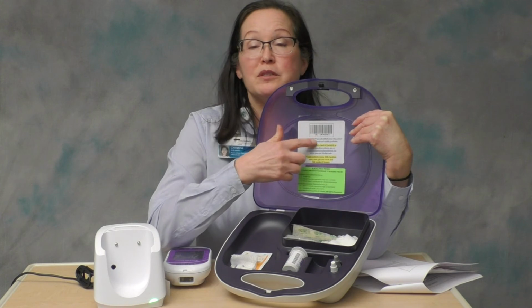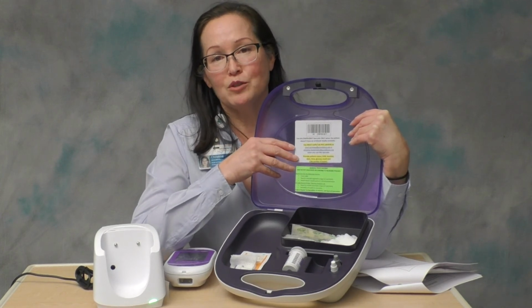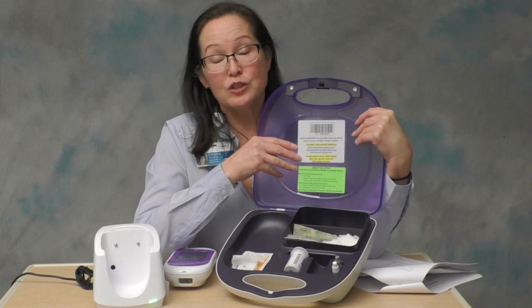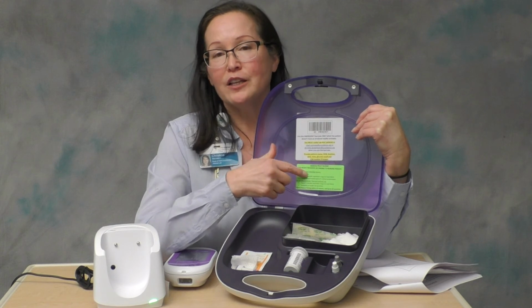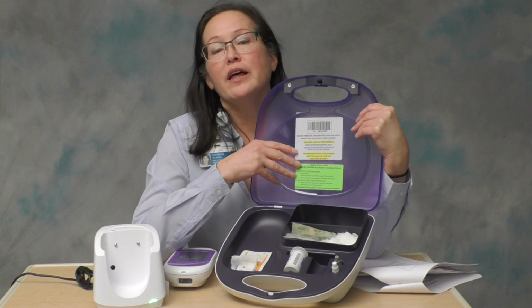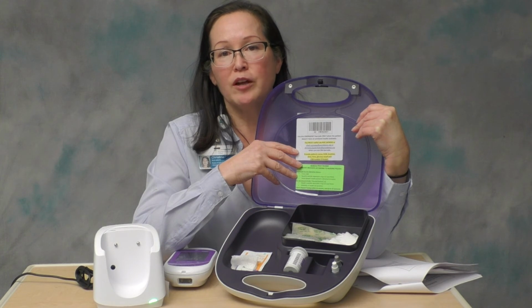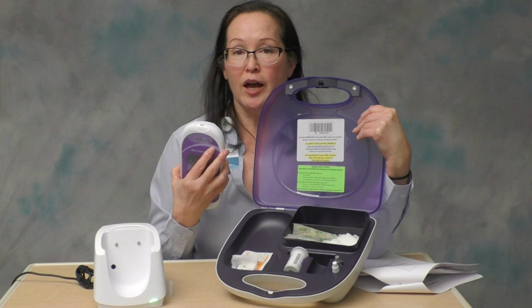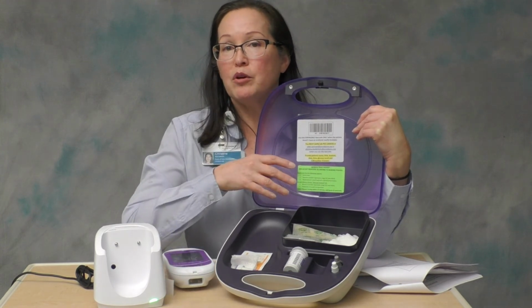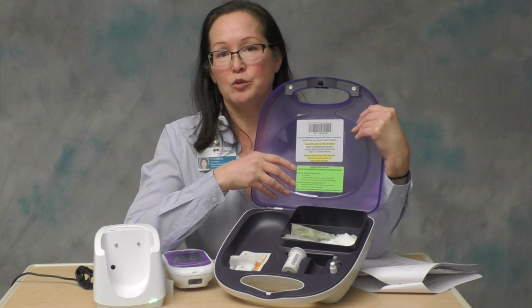So there are very specific instructions on this sticker as to what you need to do if you use the emergency barcode. Just running the test is not the end of it. You have to call our office, let us know you used the emergency barcode, give us the patient's name and date of birth, or let us know that it was a non-patient that you ran the test on. We need to know which instrument you used and the date and the time. If you have the CSN number and can give us that, that's great. If not, we can look it up with the information that you use.